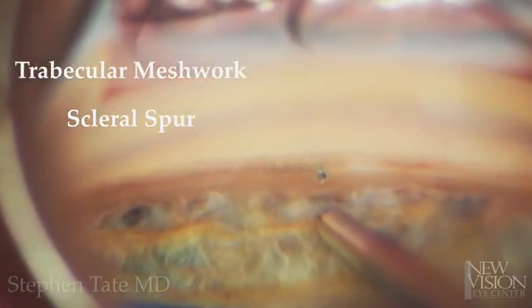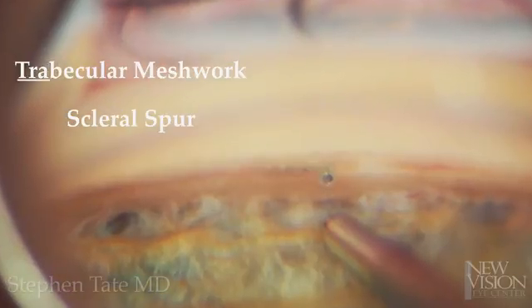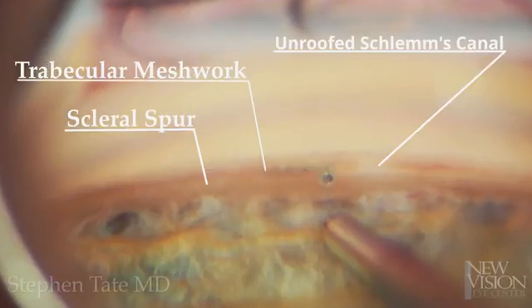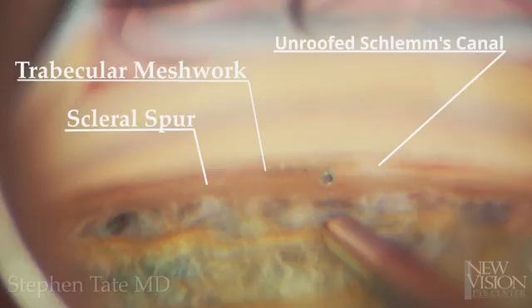Step three is angle structure identification. The cornea is coated with OVD and a gonioscopy prism is used to identify the angle structures. This step is critical to avoid placing the device into the ciliary body band or under Descemet's membrane at Schwalbe's line.